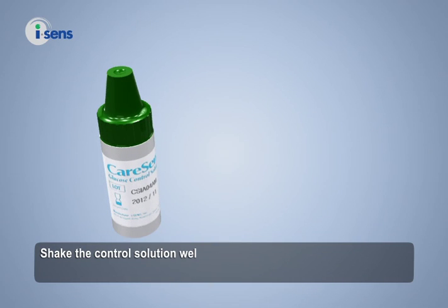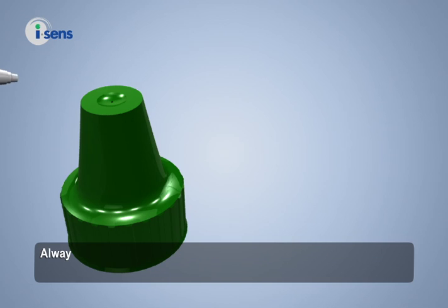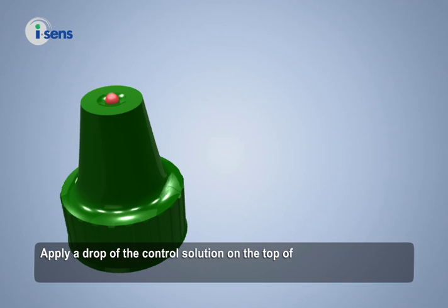Shake the control solution well before using. Wipe the tip of the control solution cap with a clean tissue or cloth. Always discard the first drop of the solution before control solution testing. Wipe the tip of the bottle with a clean tissue or cloth, then apply a drop of the control solution on the top of the cap.